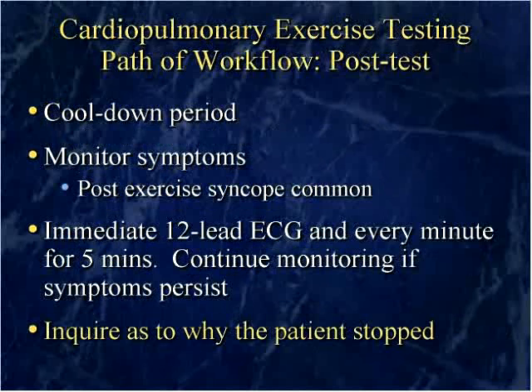During the cool down period, we want to monitor their system. We want to make sure in particular that we monitor if they get lightheaded. It's very common that a subject gets lightheaded post-exercise, even if they're doing a cool down. Somewhere in between 2 to 4% of the individuals get significantly lightheaded, and so we need to monitor that. We need to monitor their electrocardiogram, and then we always inquire why you stopped.